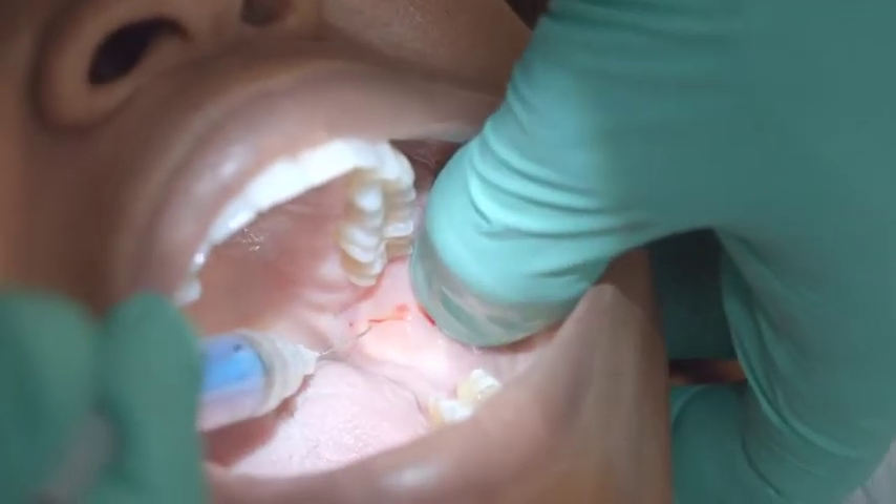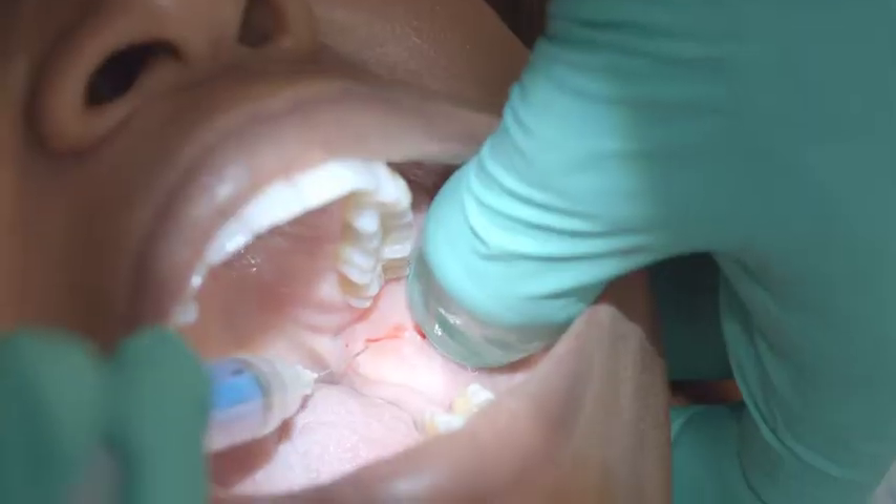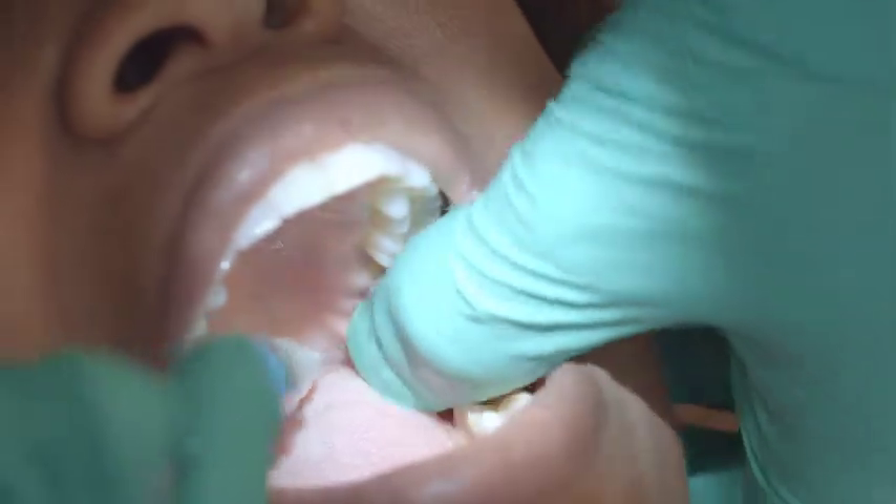I make sure I'm absolutely on the bone, coming on the inside of the mouth towards the tongue, and I slide that needle down parallel with the ramus. The nerve trunk for the inferior alveolar nerve block splits off into three different nerves: the long buccal, the inferior alveolar, and the lingual. Many times when we do the old traditional Halstead injection, we miss the long buccal. With this technique, coming in parallel to the ramus first and injecting a little along the way, we hit all three nerves — the long buccal first, then the inferior alveolar, and the lingual.